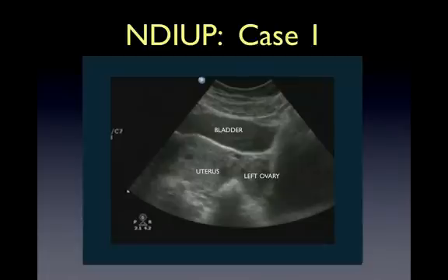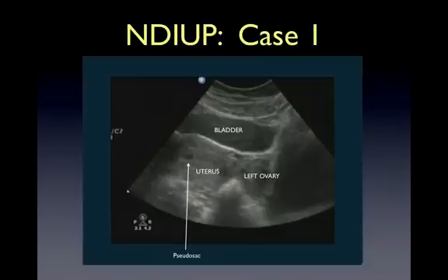Here's one example of an NDIUP. We are looking at a small sac in the uterus that is not surrounded by a double decidual sign. This is called a pseudosac. A pseudosac may indicate a very early pregnancy, but may also be present in ectopic pregnancies.